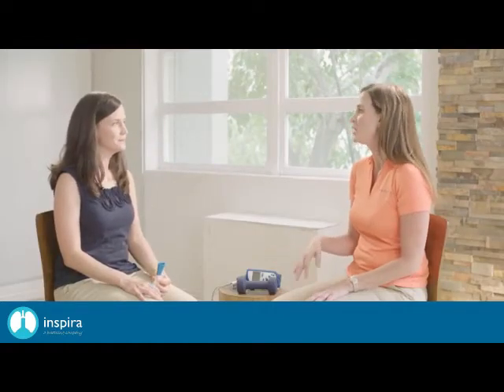Yes. Okay, so it's important to sit up when we do these exercises. Your shoulders shouldn't move up and down as you breathe. You want to make sure that you're using your diaphragm. Okay, when you're using the Breather, make sure your stomach moves out when you inhale and returns back as you force air out for exhalation. This is called diaphragmatic breathing. So let's try this now with the Breather.